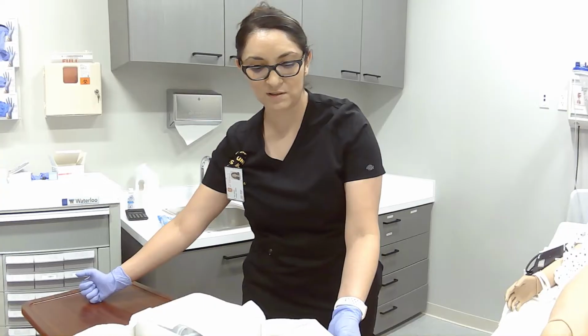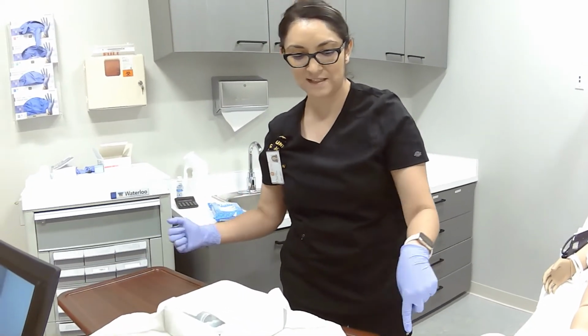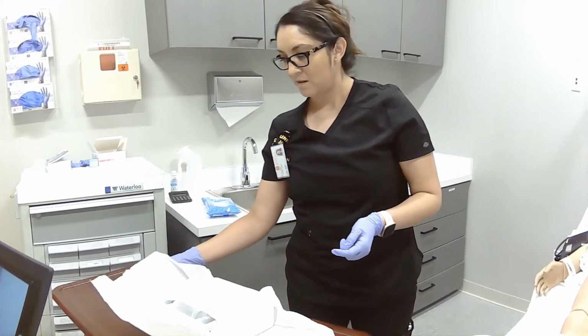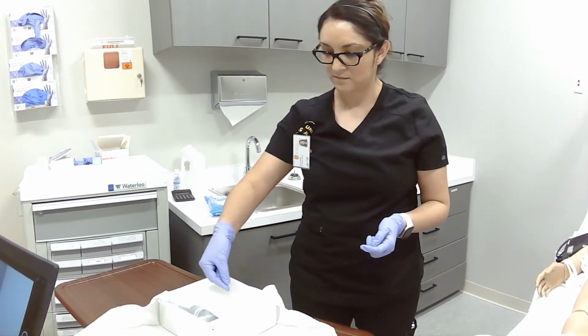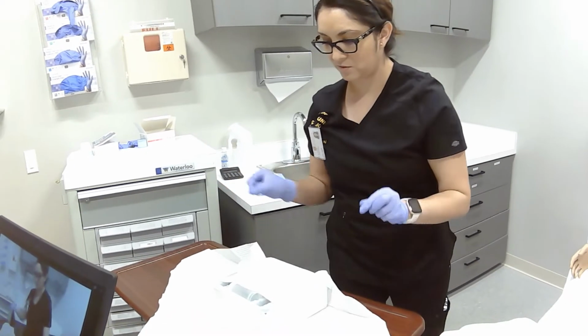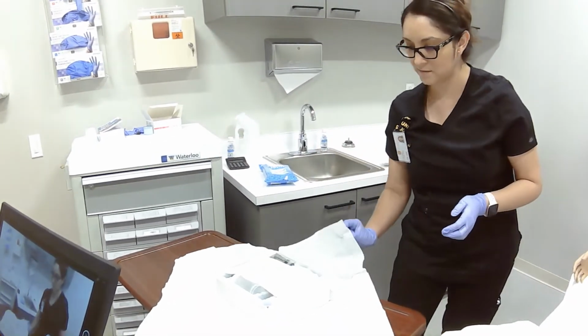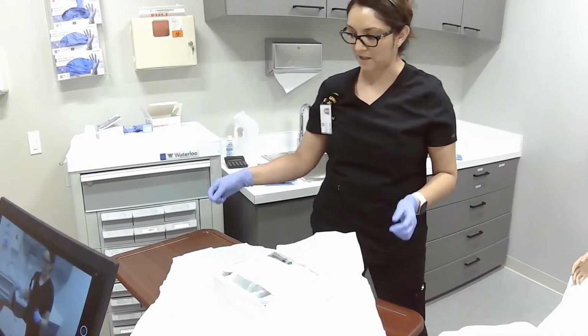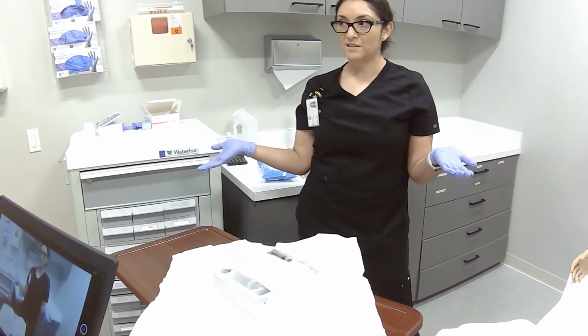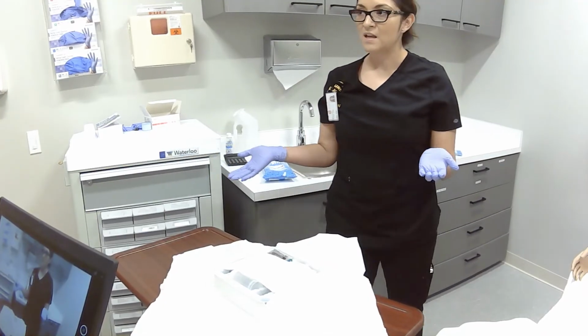I can move my table a little bit so I don't potentially contaminate with the sheet. And then open it this way. So make sure the drape stays open, so that way it doesn't fall back onto your sterile field. So this is what the Foley kit looks like when it's open, okay?